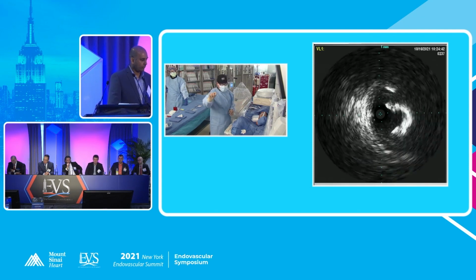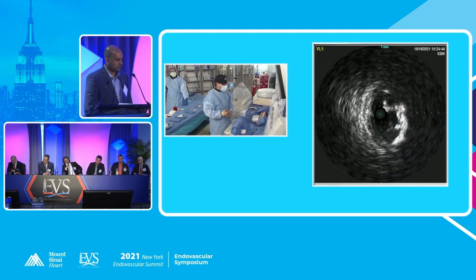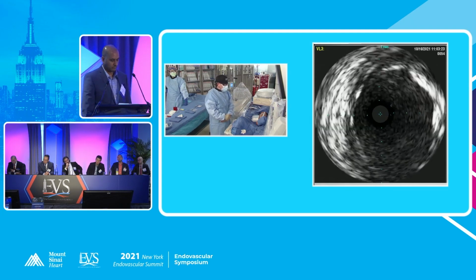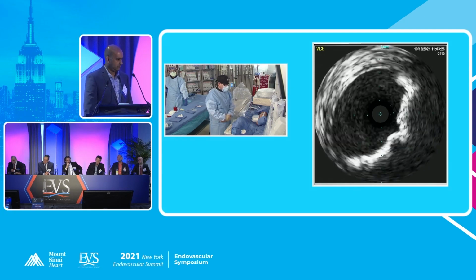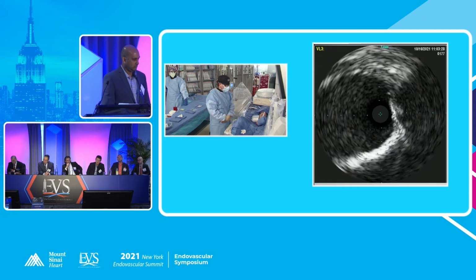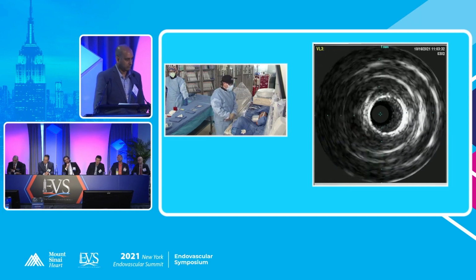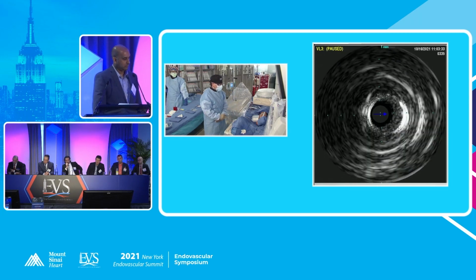All right. Now show the IVUS after we just did this. You can see the IVUS. Okay. Now go ahead and play it, please. This, folks, is the post. There's a little calcium. That's what we're seeing on the lateral wall. But I would say we're widely patent without any significant dissection.